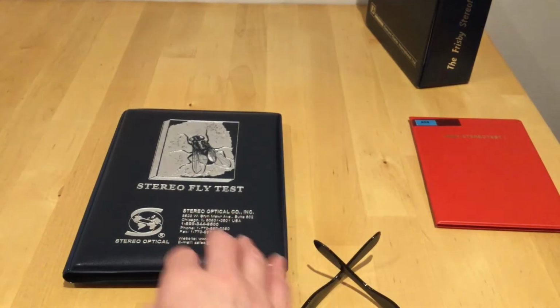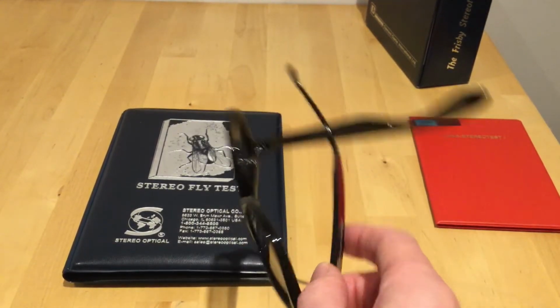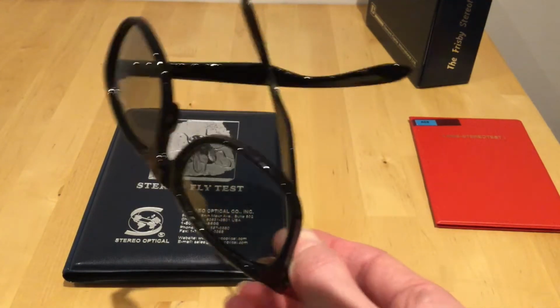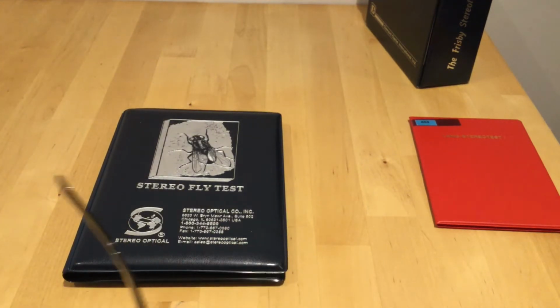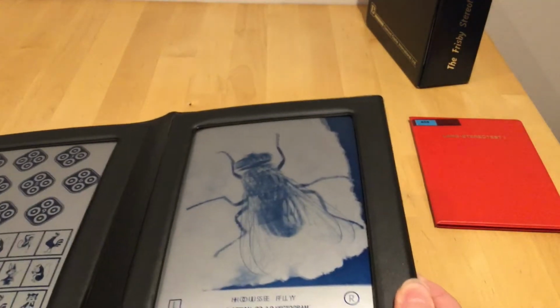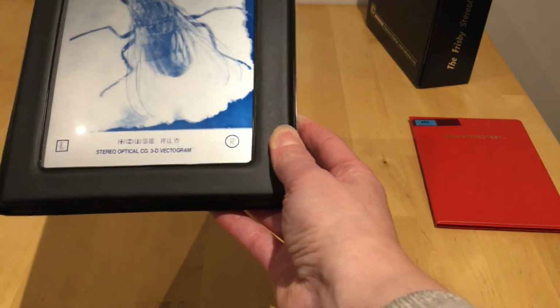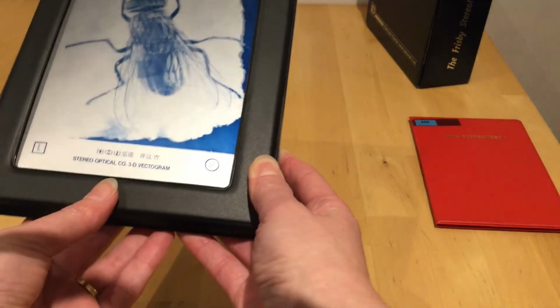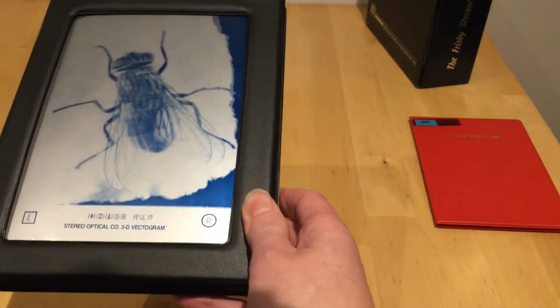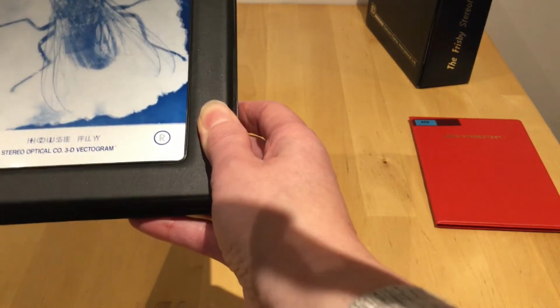Now this comes in a small folder and also with a pair of glasses, almost like the glasses that you would get if you were going to see a film in 3D at the movies, and the child or young person wears those glasses. Once they are on, the test book is presented and the page is opened, and you might cover up this page because this is the fly here, you can see, and when you're wearing the glasses, the wings of the fly stand out, and you ask the child to touch the wings of the fly, so you should be able to see them pinching their fingers in mid-air and not actually touching the plate of the book. I'm going to put the glasses on.